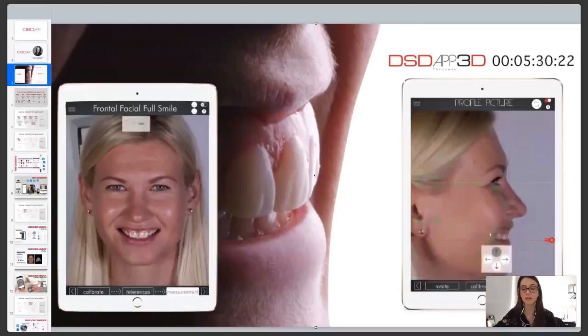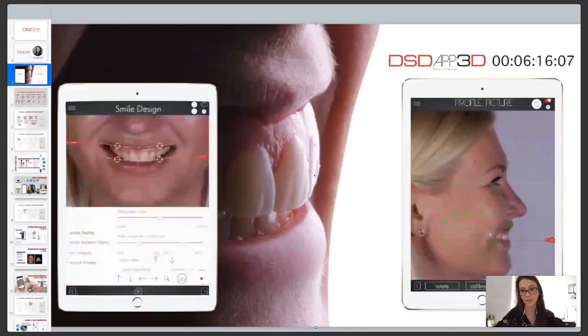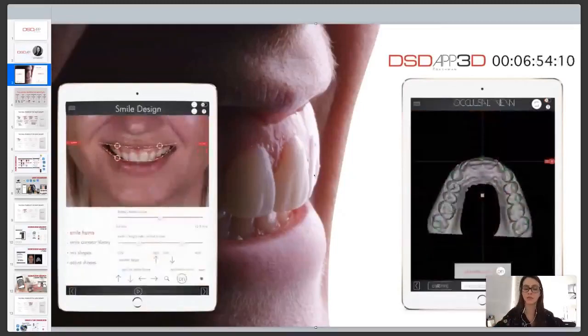And towards the end, we're going to start with a step-by-step of the 3D design. We are going to have 2 webinars. So this introduction and the first part of 3D, and then a second one to finalize the design.